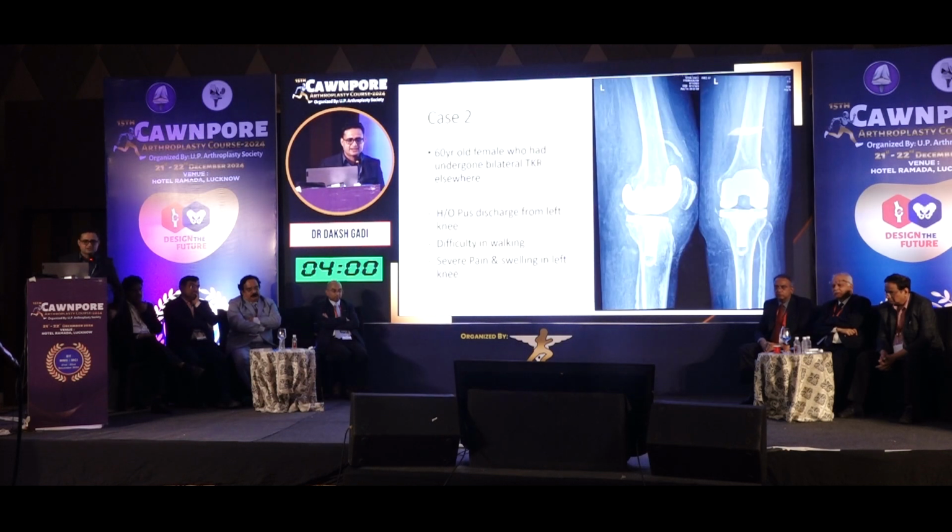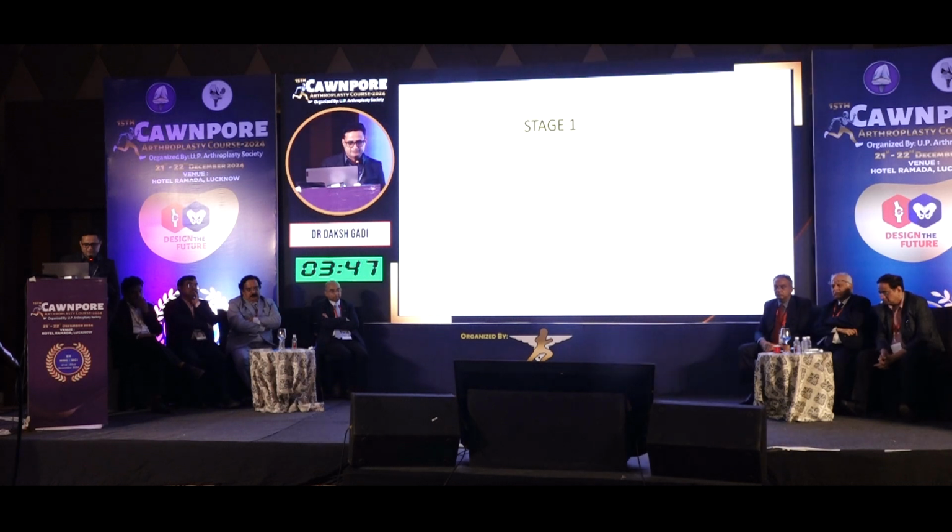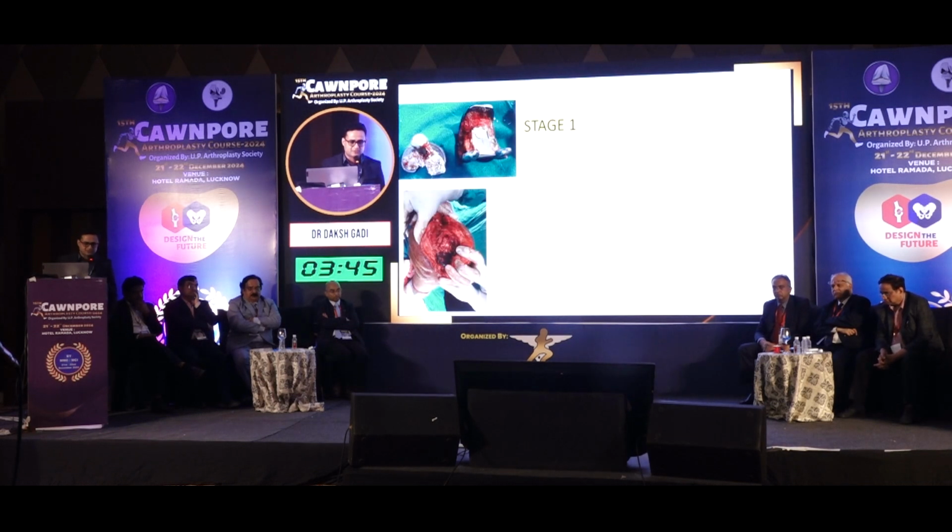This is the second case of a 60-year-old female who had undergone bilateral TKR elsewhere. She had a history of pus discharging sinus from the left knee, and difficulty in walking, severe pain and swelling in the left knee. So similar stage 1 was done.